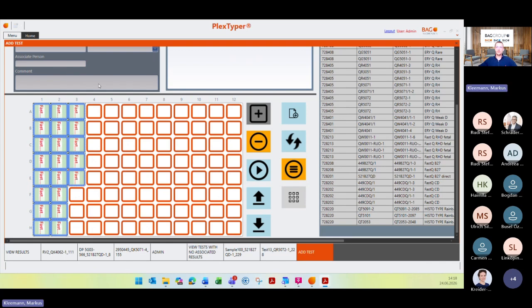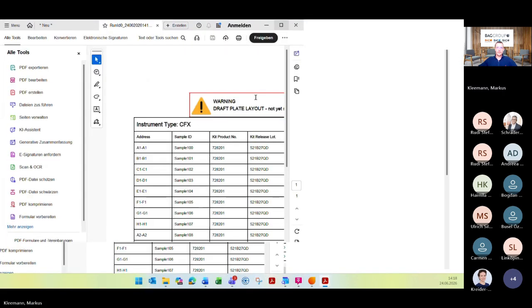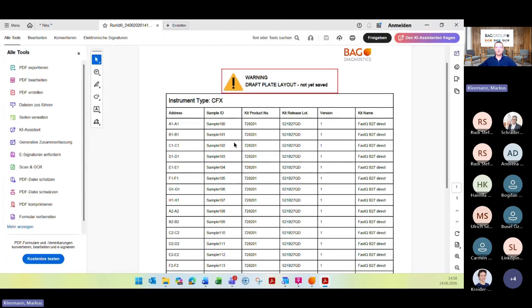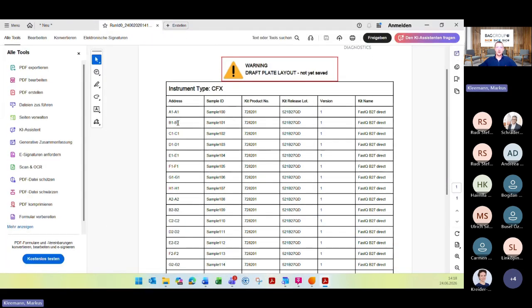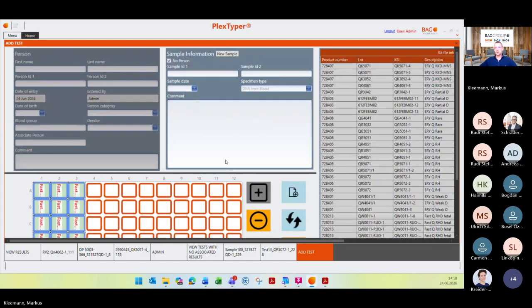I just move this here to my window. So yeah, it looks like this, where you get the address of the well position, the kit name, also the lot, and my sample ID. And this you can print and work with in the laboratory.